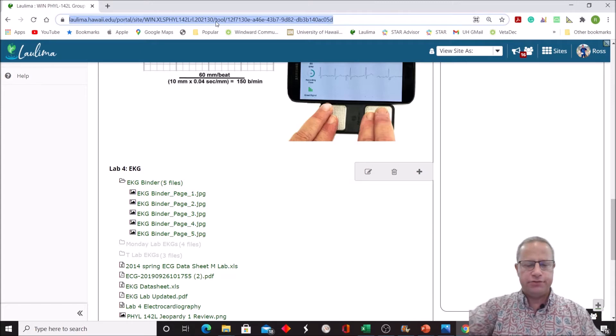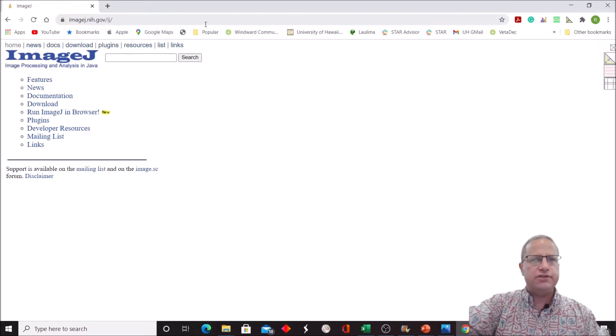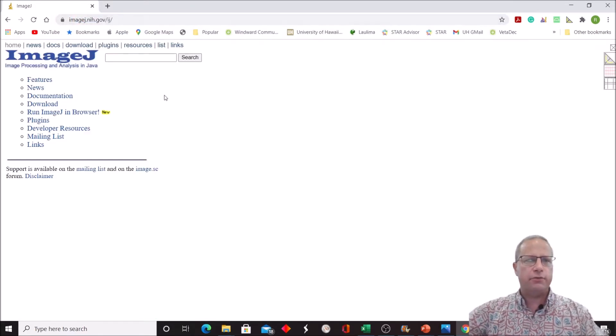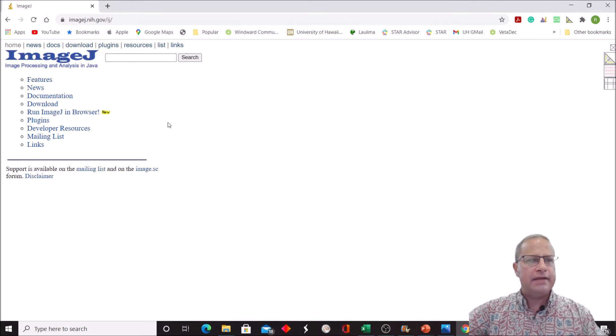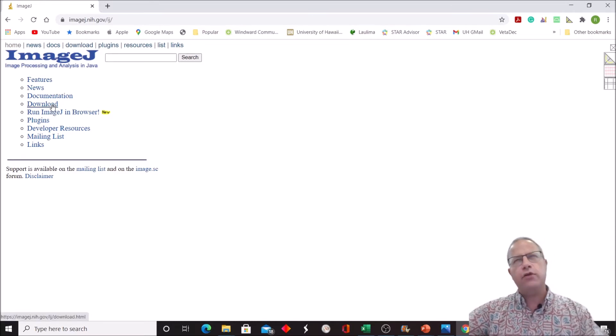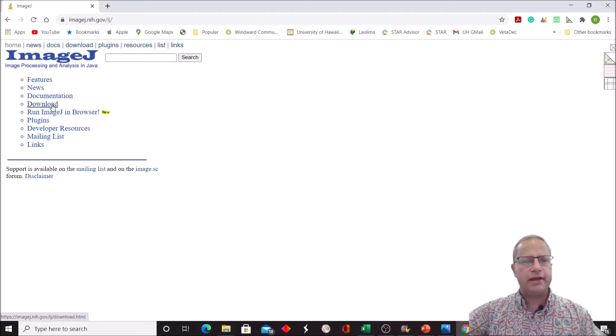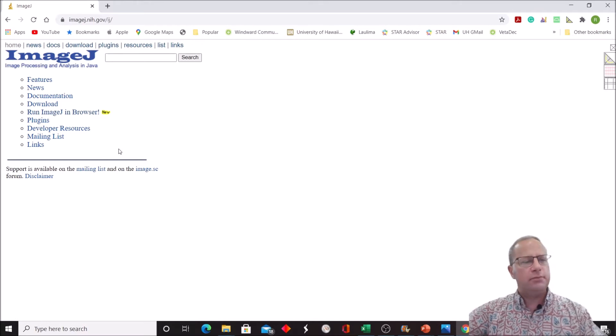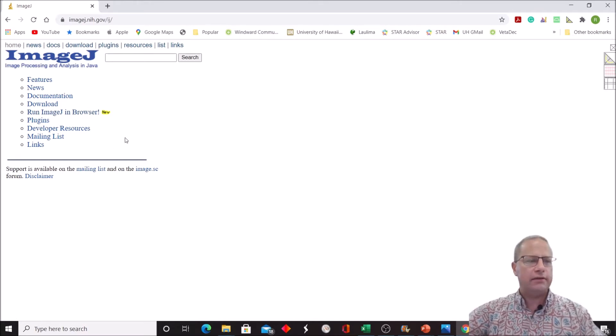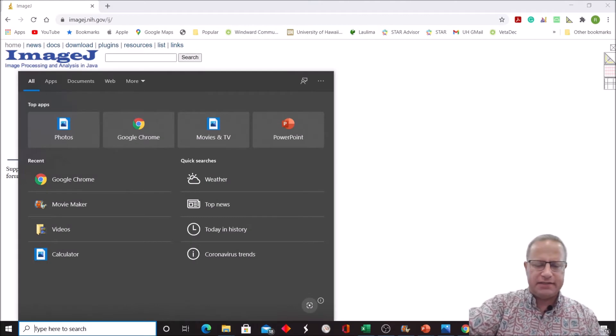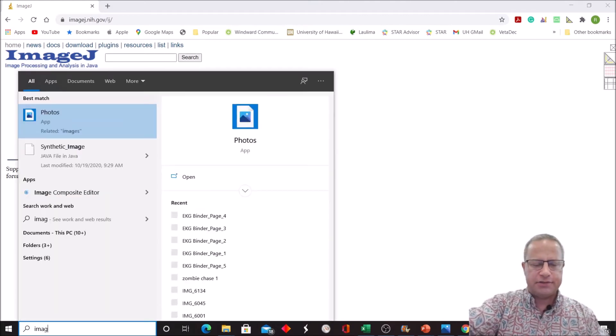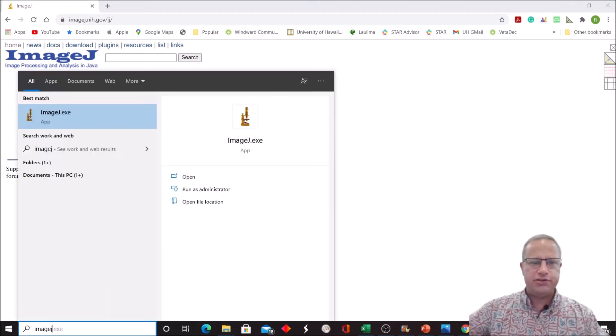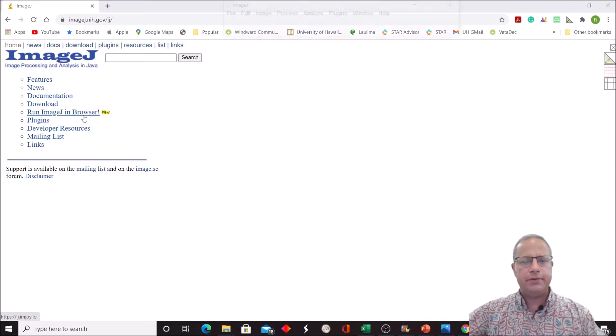Now I want to go to ImageJ. ImageJ is the software we use to download and analyze it. You can download it easily and run it on your PC. For a Mac, it's more difficult, so if you have a Mac just try to run ImageJ in the browser. It's clunkier but easier than downloading the software. I already have a PC and have it installed, so I'm just going to search for ImageJ and open it up.